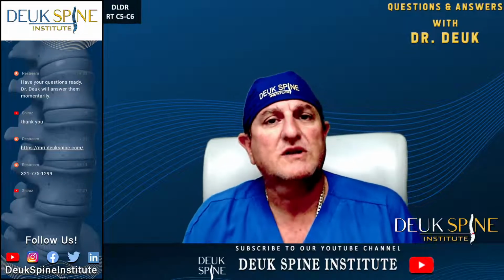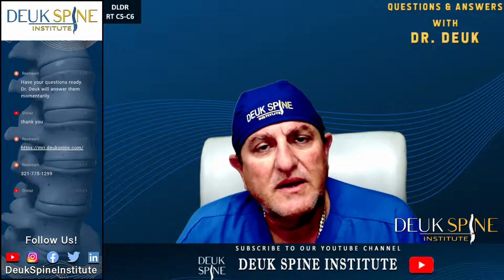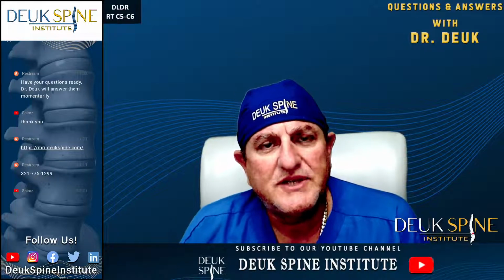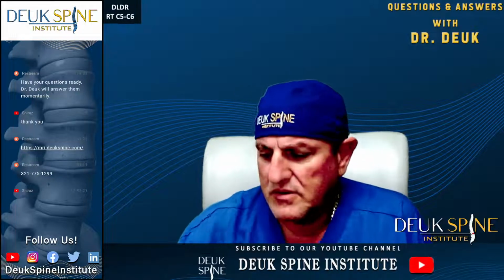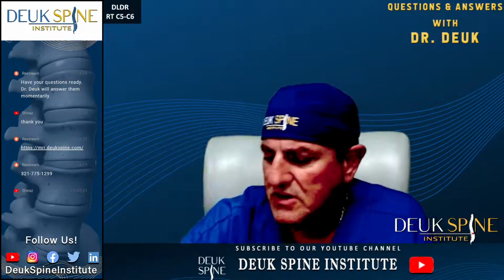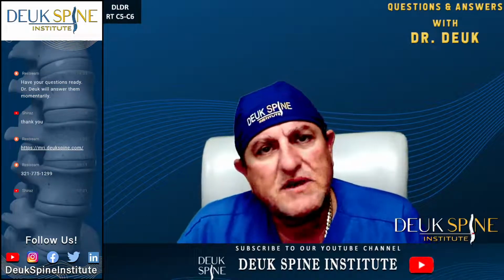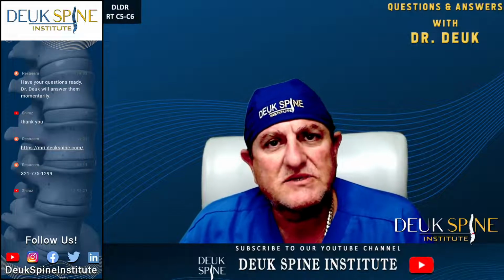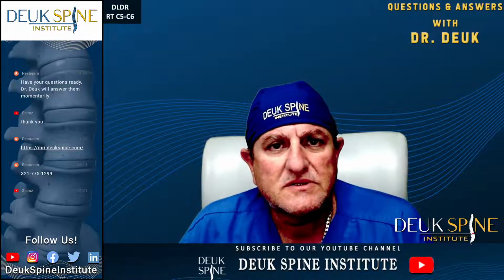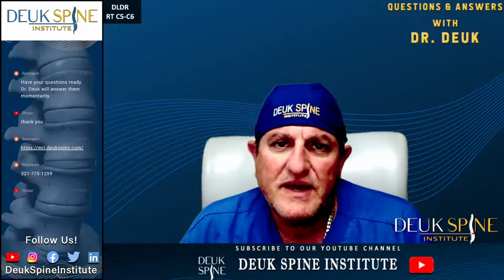The surgery you just watched today is called the Deuk laser disc repair. It's the next evolution in spine surgery. It goes beyond artificial discs and fusions. As a matter of fact, it sheds the need for metal altogether. Why would you want to put something so unnatural in your spine as metal screws, rods, or metal plates? You don't. That's why endoscopic Deuk laser disc repair is the next advancement in spine surgery, where there is no metal, there are no cages, there's nothing unnatural put into your spine and left there. You have natural movement of your neck when you're done.